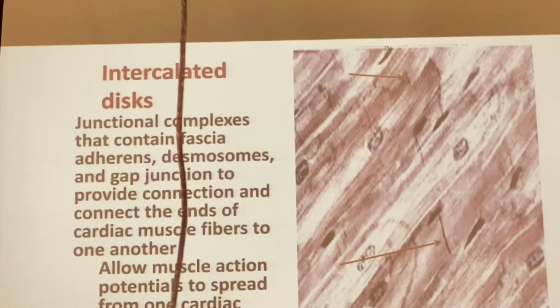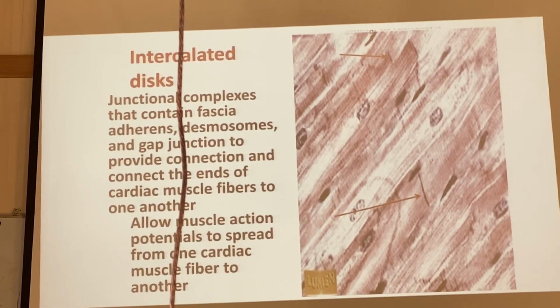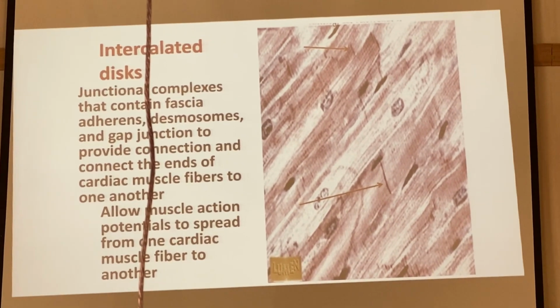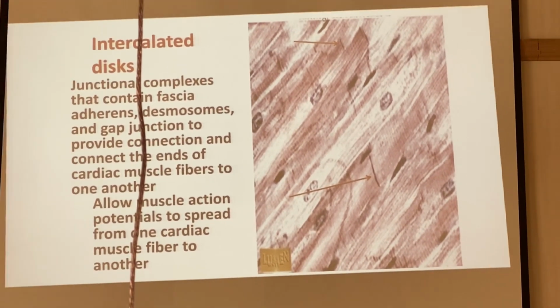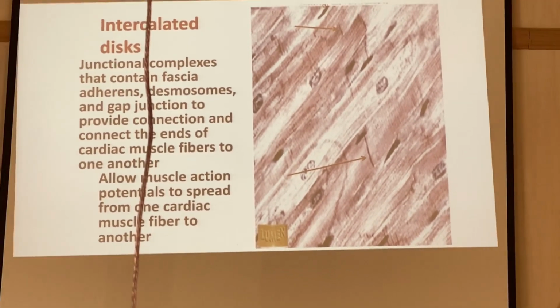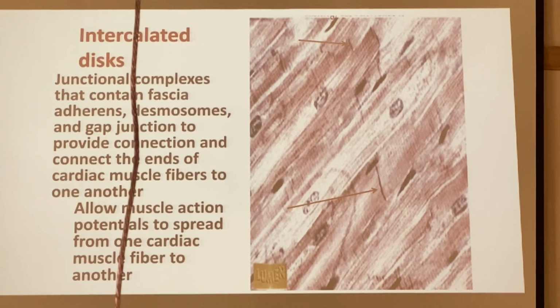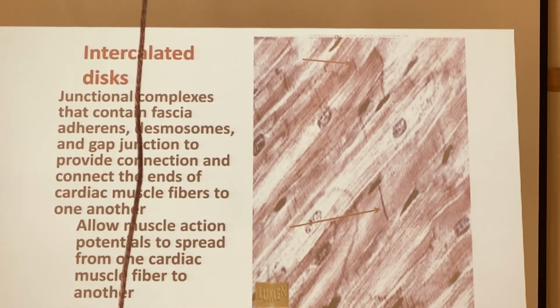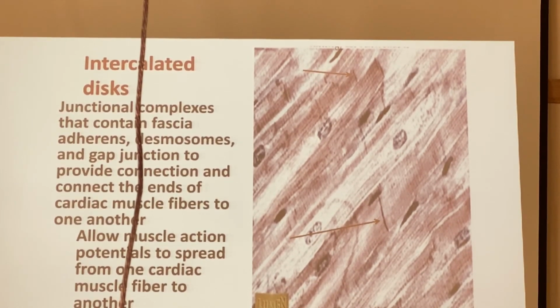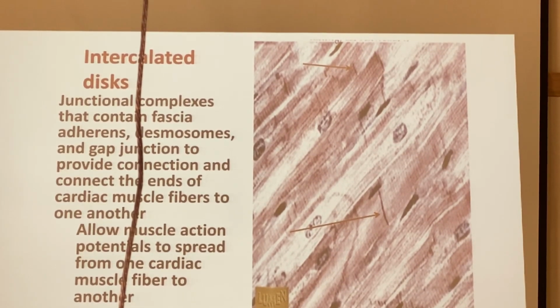You took this in physiology, no? But now we say this is the muscular tissue, and in this muscular tissue there is a characteristic feature, the intercalated disc, and this intercalated disc contains a junctional complex, and the junctional complex, we said, is one of the characteristic features of the epithelium. What's wrong is if we say that this muscle cell is also coming from that single cell from which the epithelium is coming.